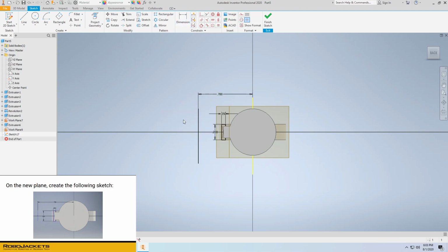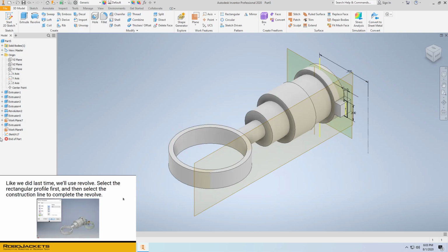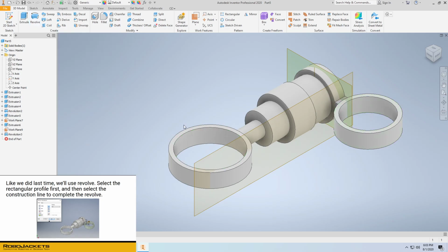Oh, no more dimensioning. There we go. Construction line, just to be sure. And we'll finish up this sketch. Now, we'll revolve it, choosing our sketch as the profile and the construction line as the axis. There we go. Now this looks right.